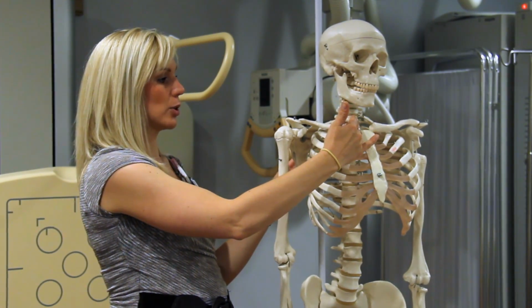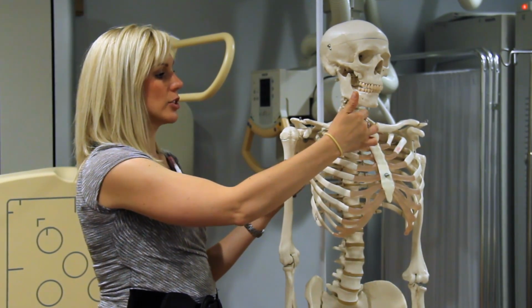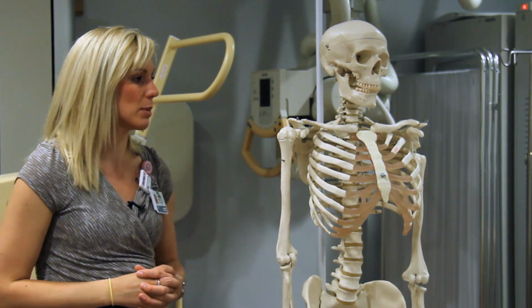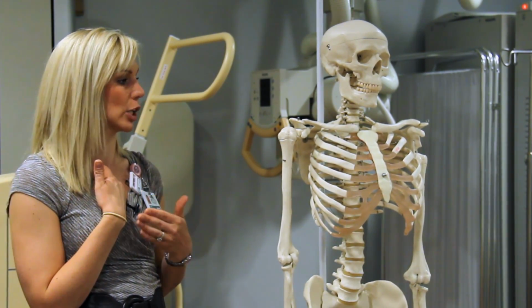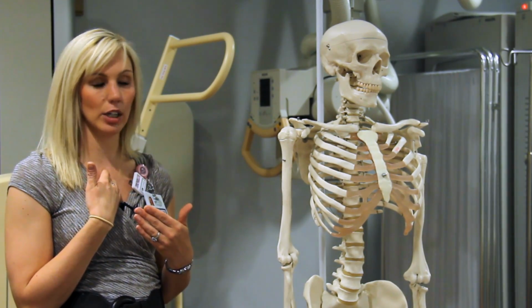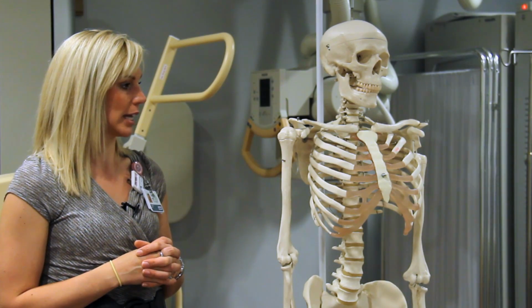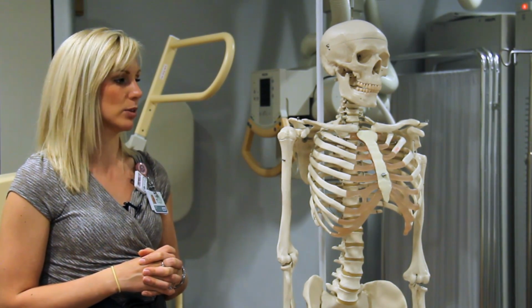You always have to make sure that you include the entire clavicle in at least one of your images. And so the SC joint, the sternal end of the clavicle, also becomes an important landmark to feel and palpate on a patient to make sure that we do include at least that far over. Those are about the main landmarks that you'll be able to feel on pretty much all of your patients most of the time.